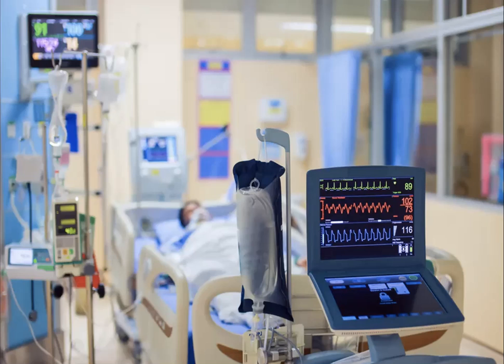But these devices make many hundreds of alarms per patient per hospital per day, which results in a large cacophony of sound. The challenge from a health perspective is that this large amount of sound actually interferes with patient recovery and is also constructed in a way that makes it sometimes hard for the teams trying to help patients to effectively communicate. So if you spent time in a hospital, you might hear a soundscape like this.